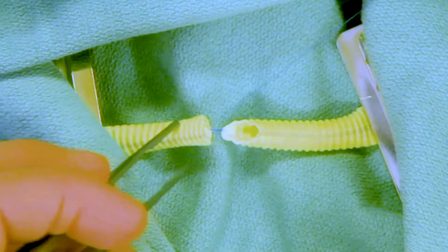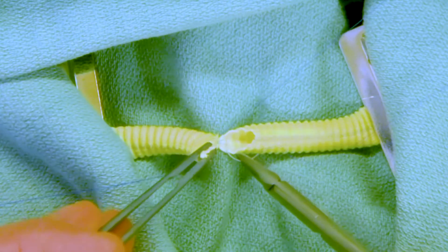It's important to actually support the two pieces of graft, or blood vessels, and not just simply pull up on the suture and let the suture do the work of pulling them together.